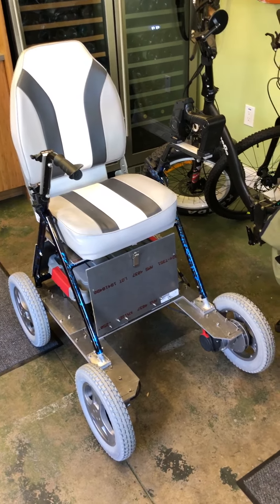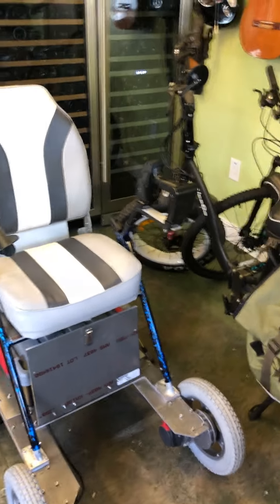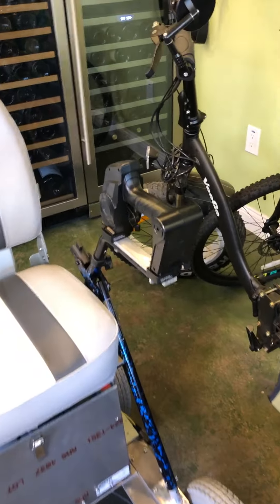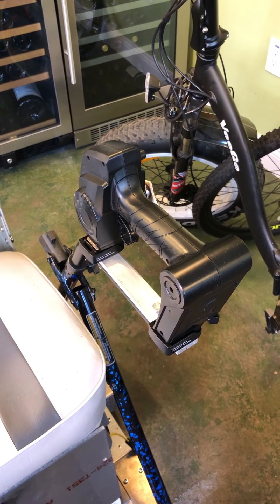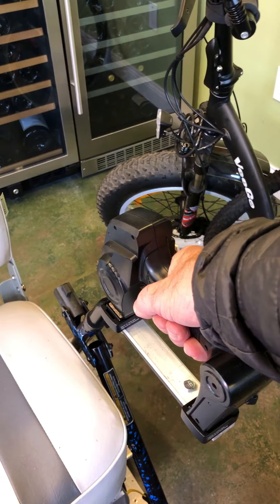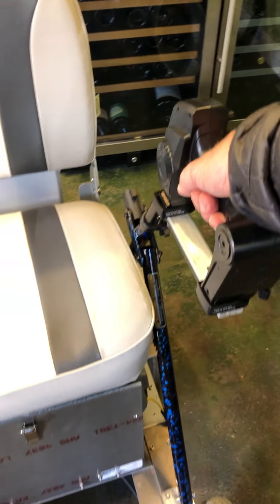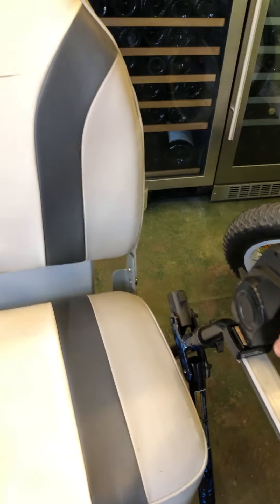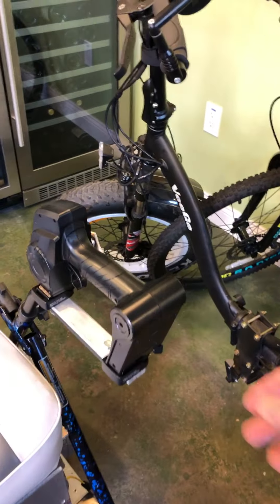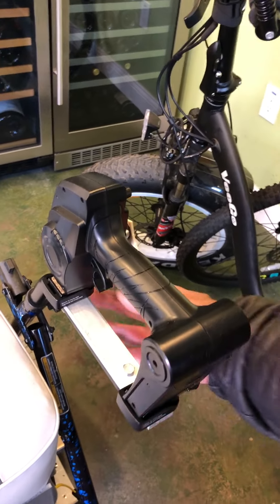So I decided to use a radio control — that's the grip here. I took a radio control and mounted it using a quick release. You can see if I pull it will go slowly forward and if I push it goes in reverse. Then I can take this off.